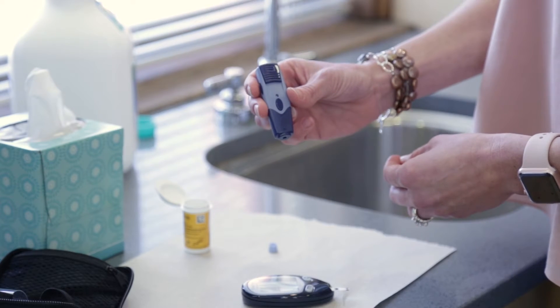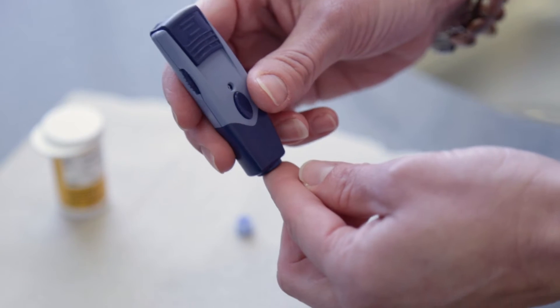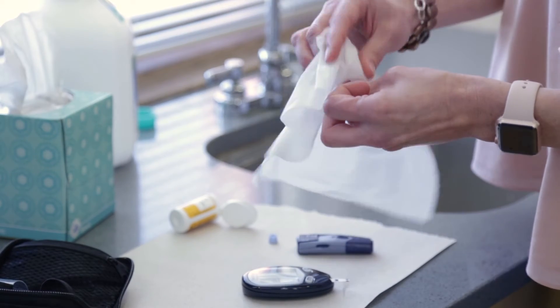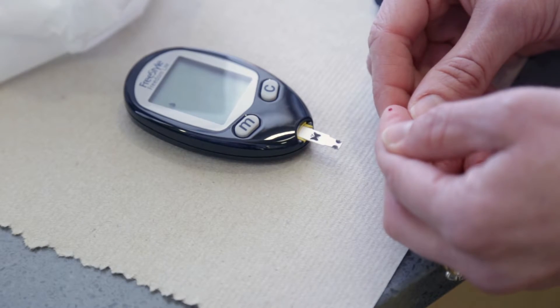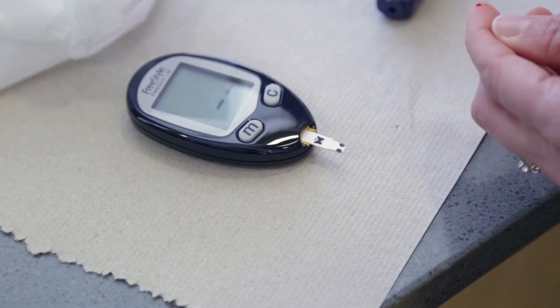Now you're ready to get a blood sample. Pick up your lancet device, hold firmly against the selected finger, and then click the button. Wipe the first drop of blood with a clean tissue. Lightly apply the next blood drop to the end of the test strip. Blood will be pulled into the test strip — there is no need to wipe the blood onto the test strip.